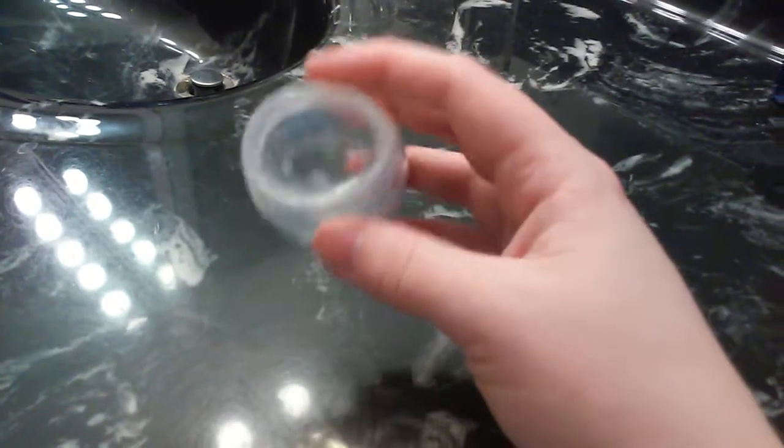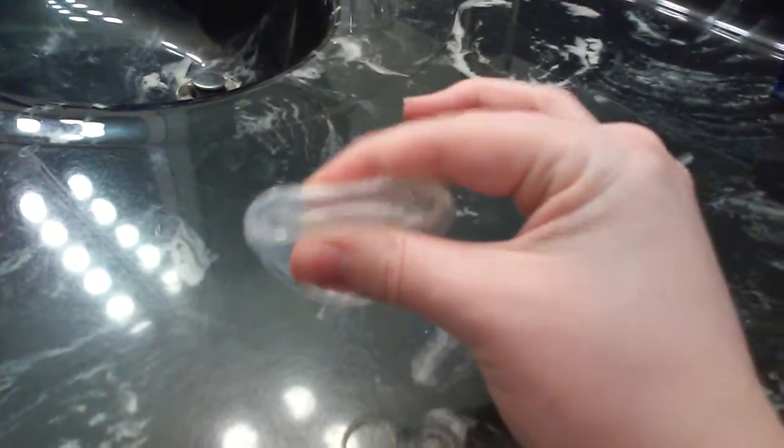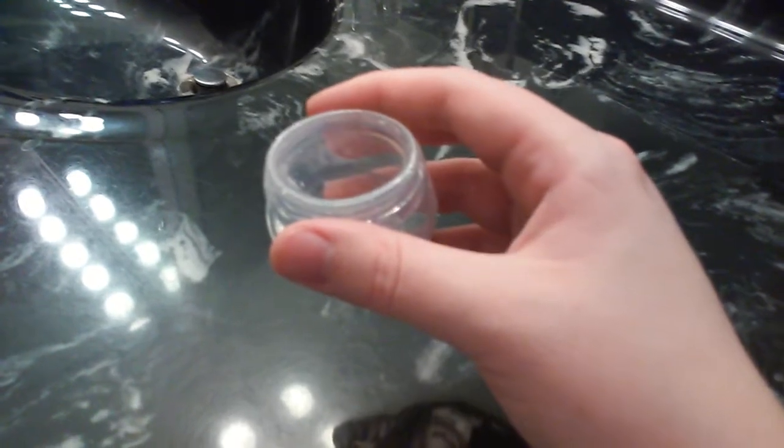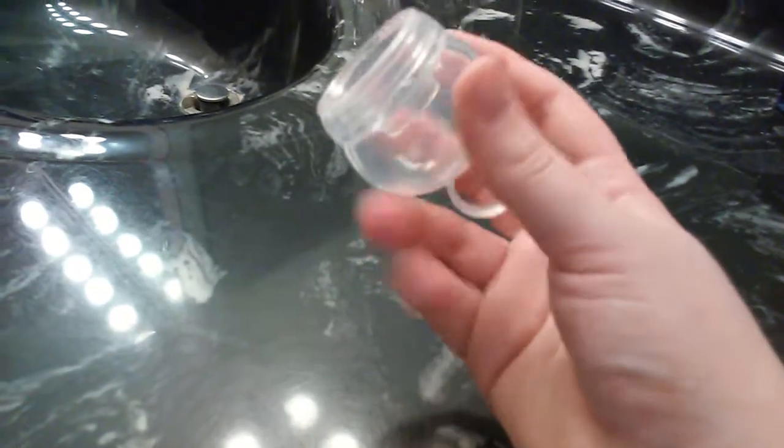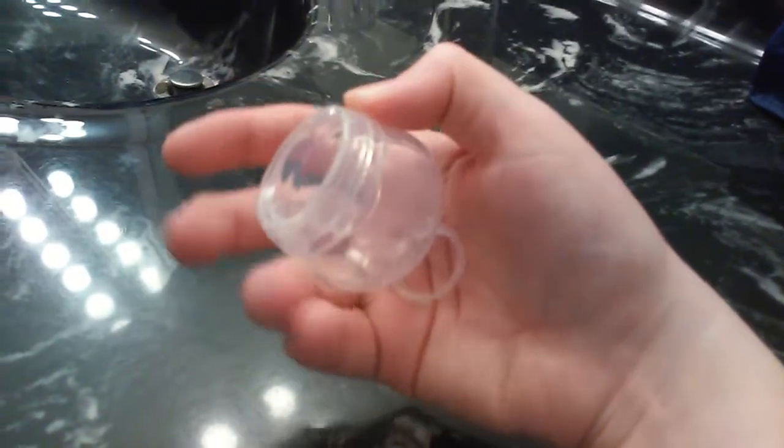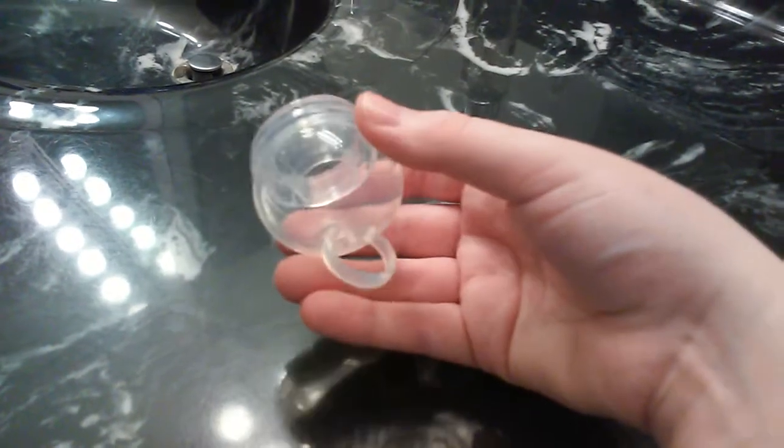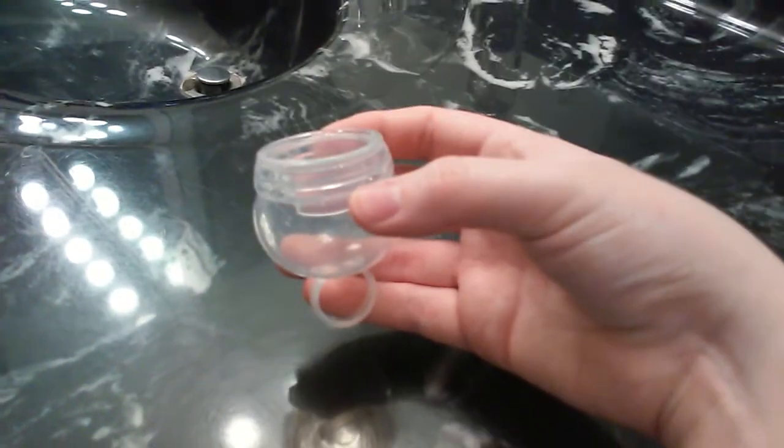I would consider this a somewhat firm cup at the top and fairly soft at the bottom. The reason I say it's somewhat firm at the top is because it does have that double rim which makes it feel much firmer. With this cup you could do the C fold to insert it. You can also do the punch down fold which is a little bit harder, makes the cup a little bit bigger to insert. I have not been able to successfully do the origami fold with this cup, but I'll keep practicing.